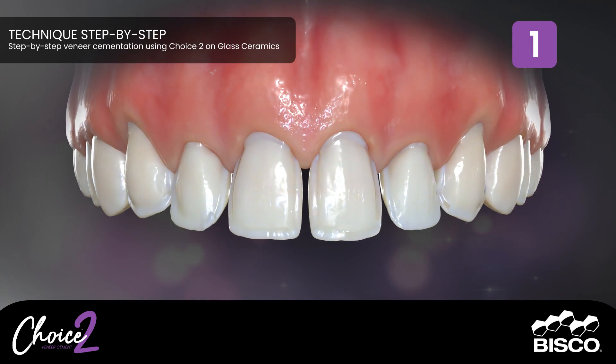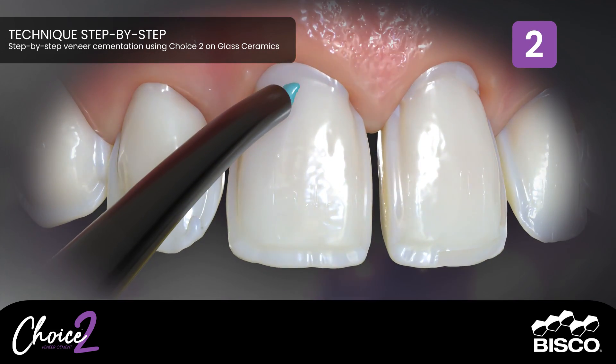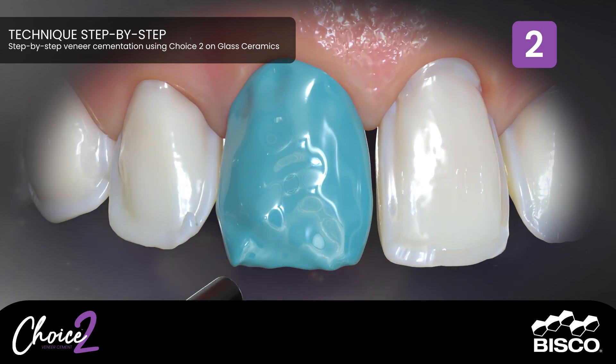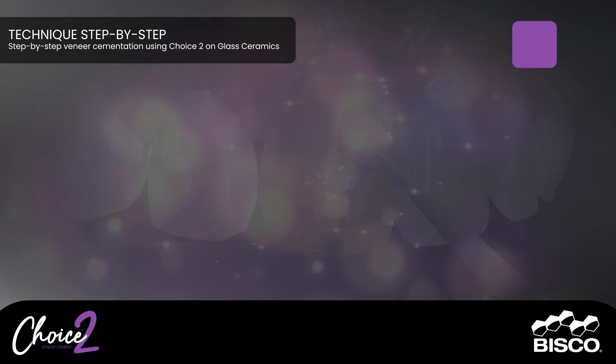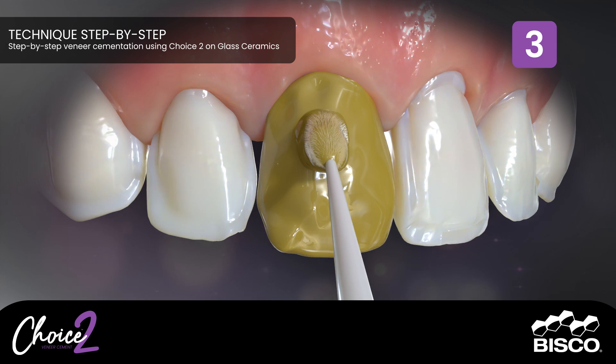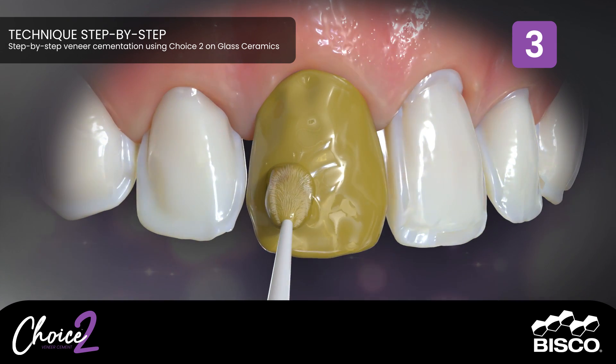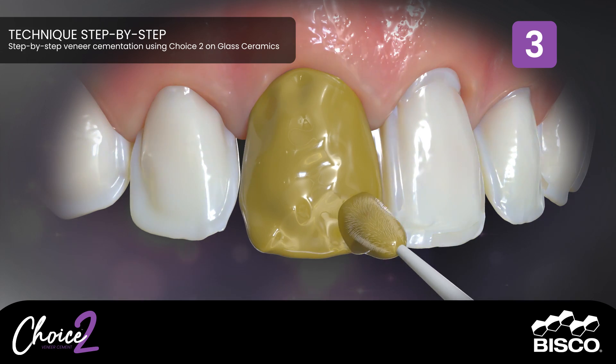Step One: Pre-operation. Step Two: Etch the preparation with Uni Etch 32% with BAC, and rinse thoroughly with water and suction. Step Three: Apply two separate coats of All Bond Universal, scrubbing the preparation for 10 to 15 seconds with a micro brush per coat.